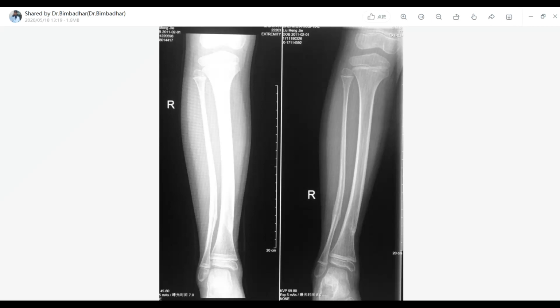You see here, it doesn't matter what kind of x-ray you are looking at, a fracture will look like a hyperlucent or black line, which is recognized as the discontinuity of the periosteum. Did you understand this? Is this clear now? But when you look closely, let us zoom in and see. Now, do you think that this is a fracture here?